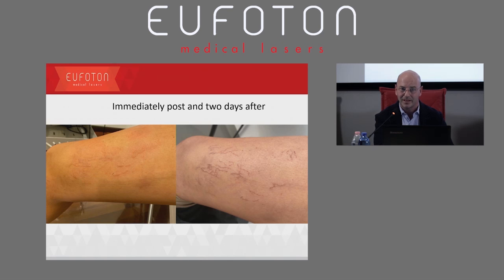Over time, we standardize the time frames and the dosages, and sometimes, whilst doing that, we would see an inflammatory reaction that would stay a little bit longer, hence creating matting, which is what we're going to talk about in a minute, hence adjusting the parameters and standardizing them so that they can fit all operators. This is the result that you see after 2 days. So a little crust. They disappear totally after a month.